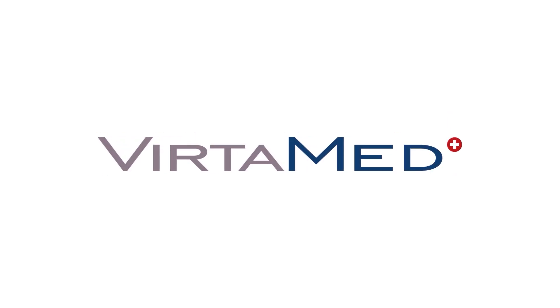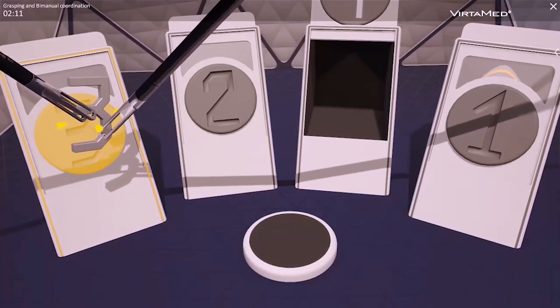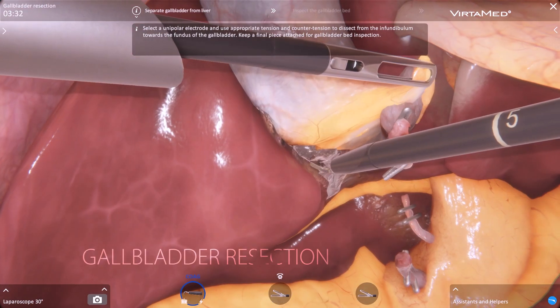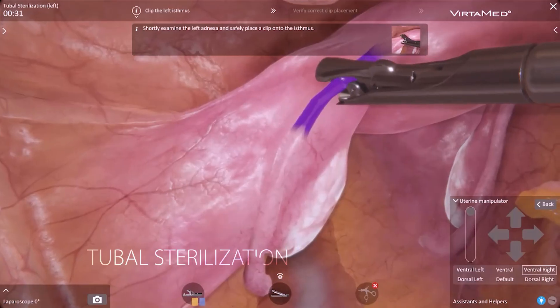You are practicing key laparoscopic skills, such as instrument triangulation, bi-manual coordination, and different dissection and resection techniques in highly realistic simulation cases.